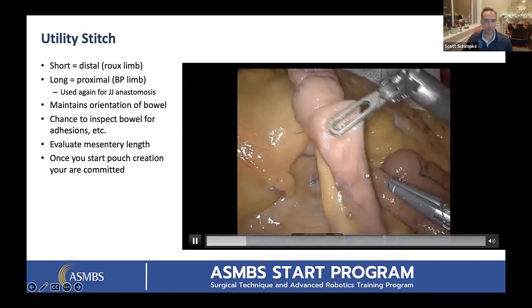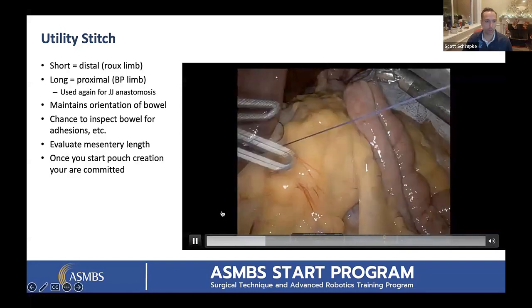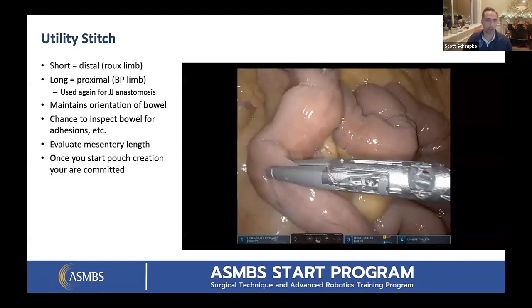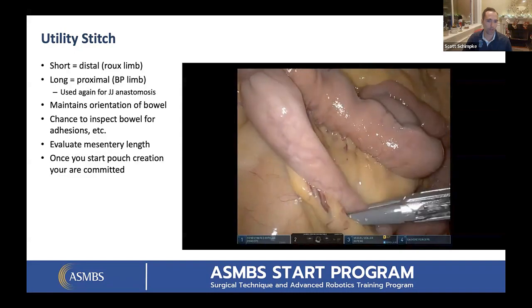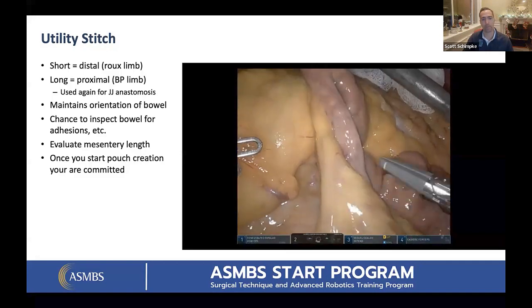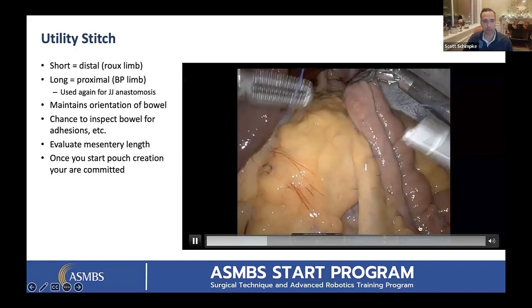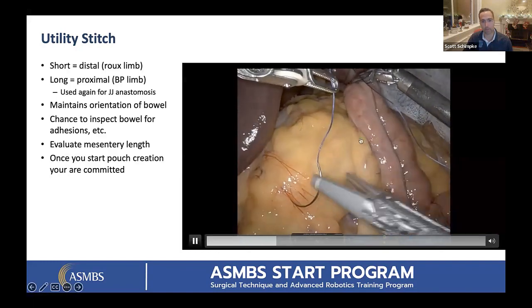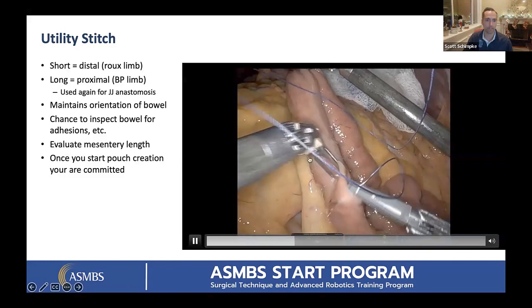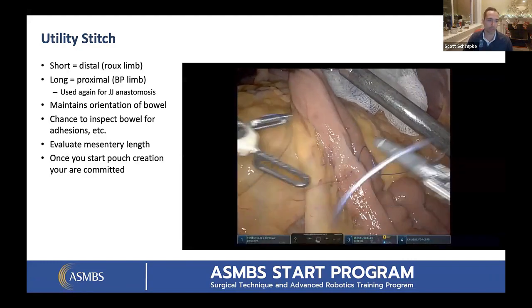Absolutely. So it's a clockwise fashion, and you can kind of see here as it goes around. So I keep the mesenteric root kind of at the center, and I'll go back one more time so you can see it. But it's really, really important. And I really harp on our fellows and residents, because if you screw this up right now, you're doomed from the get-go. You can do the best operation, but then all of a sudden you've essentially flipped your entire operation 180 degrees. So I do a clockwise fashion, around this way. When you run it that way, proximal is this limb to the right, and then moving distal, which is what I'm suturing right there. So really, really important: clockwise for this part of the operation.